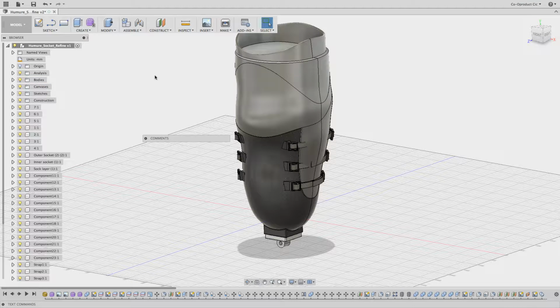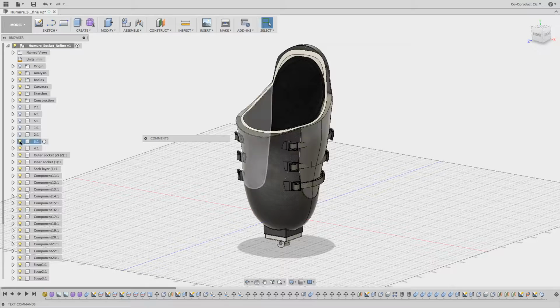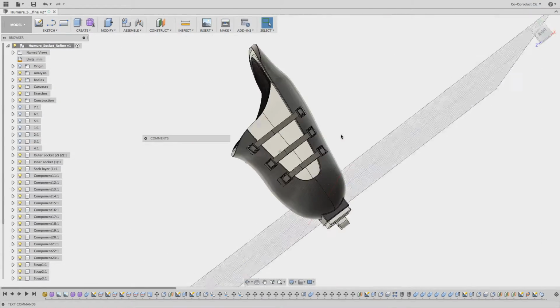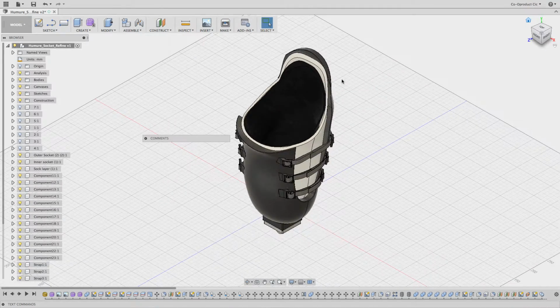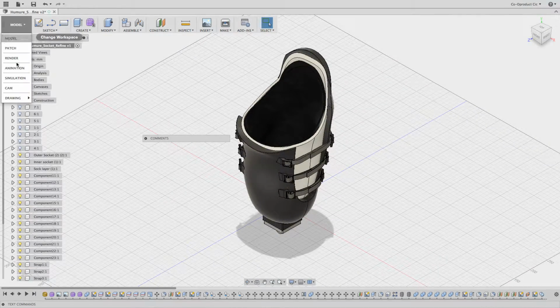Fusion produces components from the bodies, including the offset parts that we don't need, so we need to turn the visibility of those new components off in the browser. And then if we orbit around the model, we can check that the only visible components are the ones that we actually want to document. Then we need to enter the drawing workspace. To do this, select Model, Drawing, Drawing from Design.